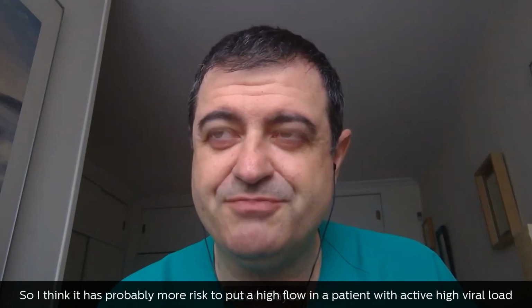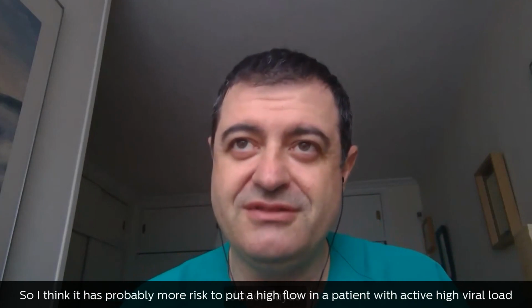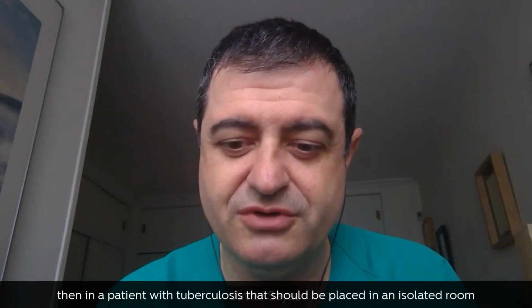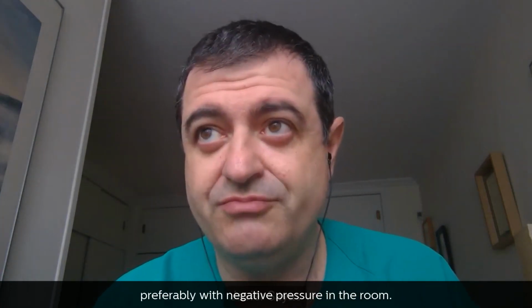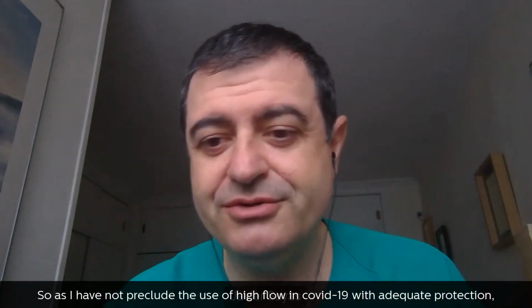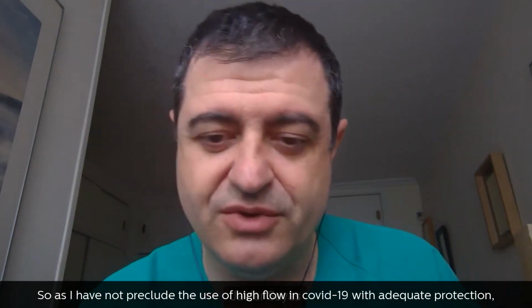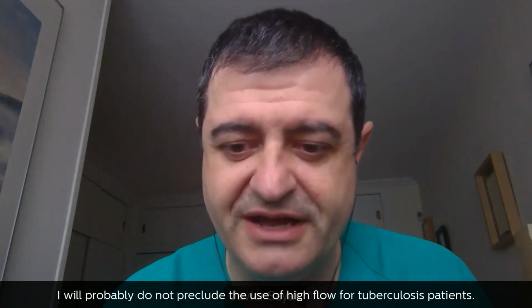So I think there is probably more risk in putting a high flow on a patient with active high viral load than on a patient with tuberculosis, who should be placed in an isolated room, preferably with negative pressure. As I have not precluded the use of high flow in COVID-19 with adequate protection, I will probably not preclude the use of high flow for tuberculosis patients.